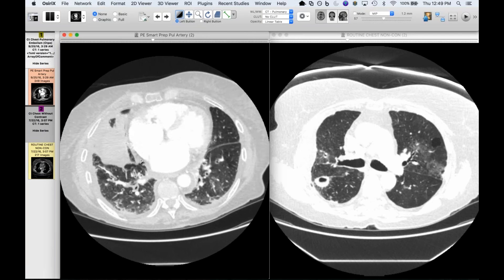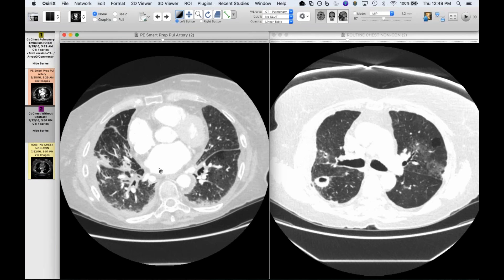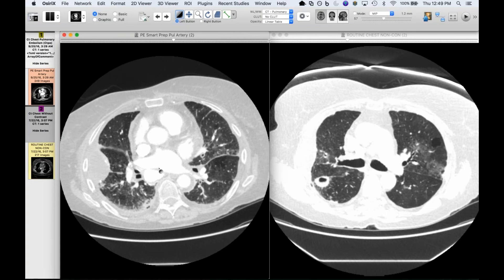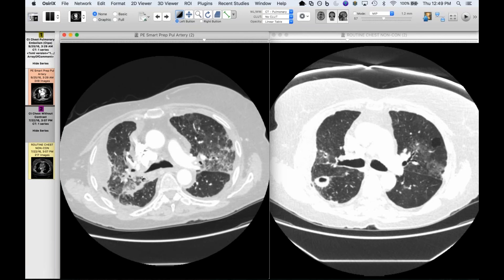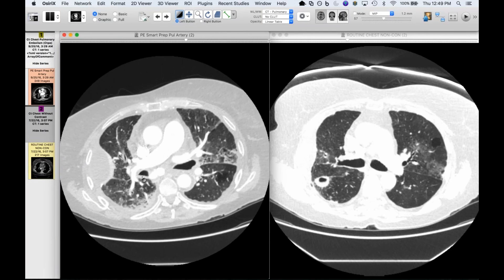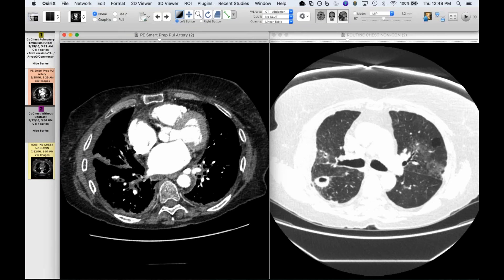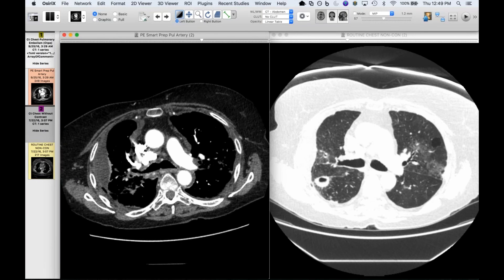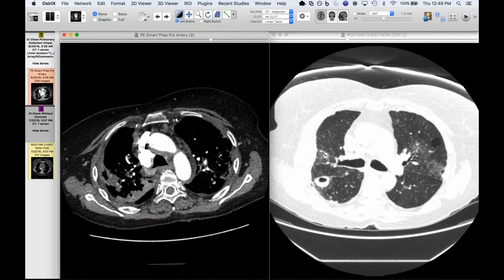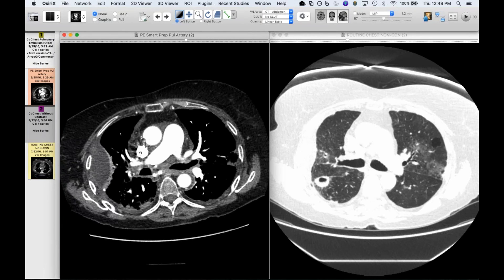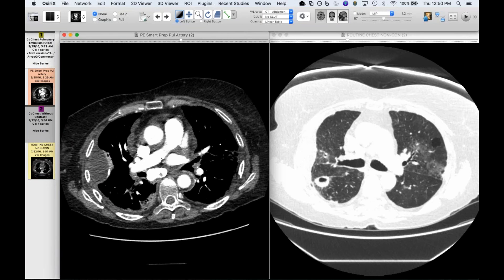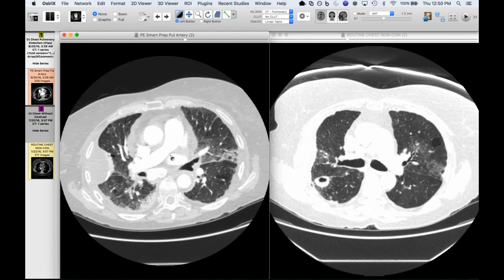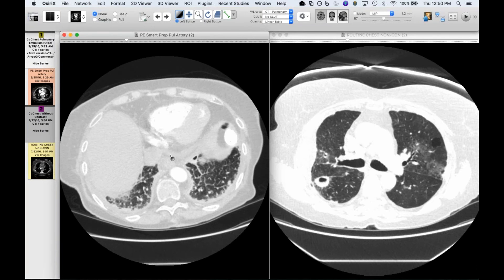I wonder about a lymphoproliferative disorder or a lymphoma — progressing quite quickly. I think this is going to be cells or something deposited in the lymphatics. Looking again at what seems to be pleura — does that look like water, or could it be tissue, like cells of lymphoma? It all measures near zero Hounsfield units. But cells with lymphangitic spread often cause congestion of the lymphatics and backup of fluid. There's some question about light chain deposition. They reviewed the outside path — it was mostly pleural with some lung, but there was no deposition at that time, and this would be awfully rapid for amyloid. You agree it looks like some sort of lymphatic process given the distribution? There are certainly septal lines and peribronchial fluid cuffs on both sides that have developed — the lung is wet, and the question is what is the mechanism. Are the lymphatics obstructed?